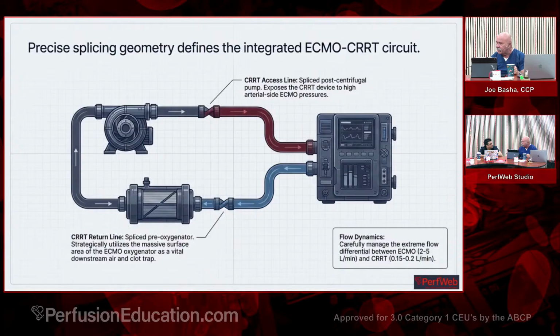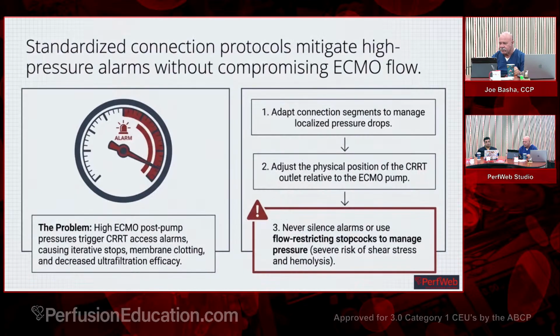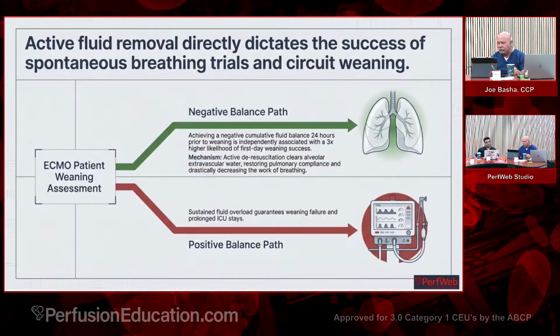I didn't know ELSO doesn't allow the... No, they recommend. Okay. They don't allow or disallow anything. This is a recommendation for their ECMO specialists. Yes. Not to have positive or negative openings. Exactly. I think we went through all of this, alarms. I don't want to go through all of that again.